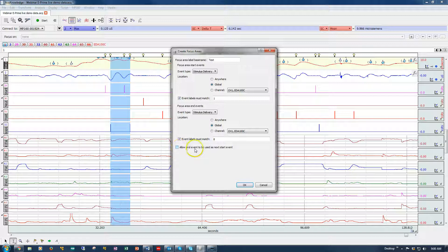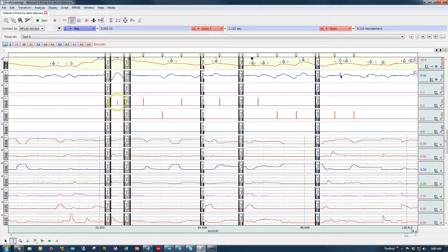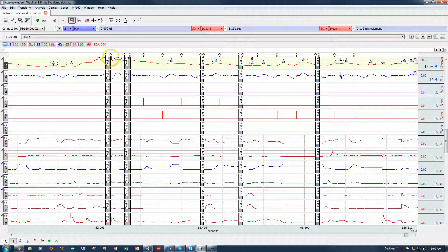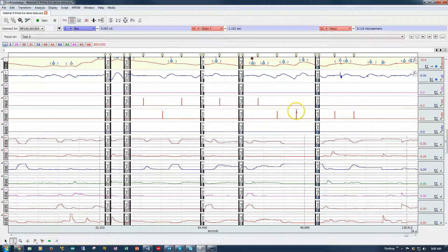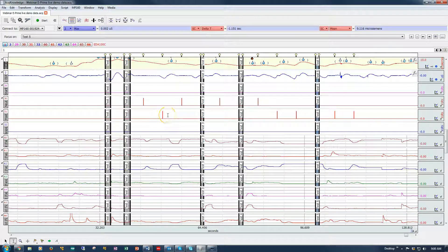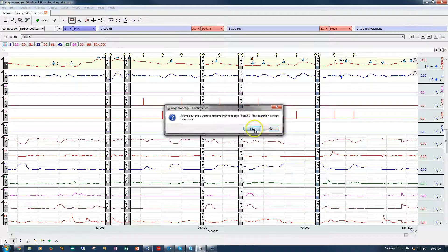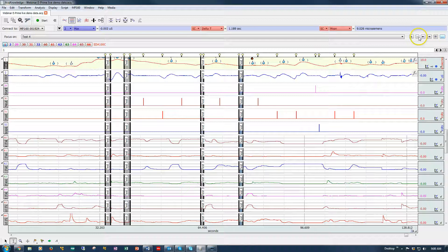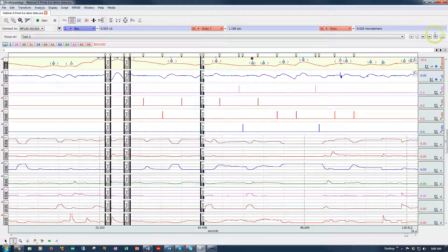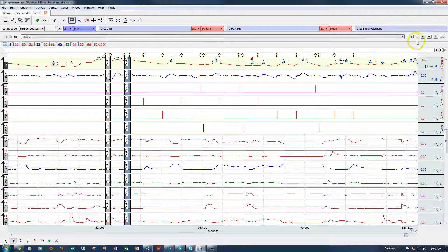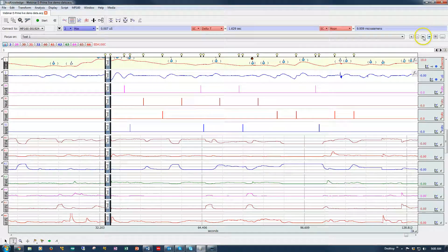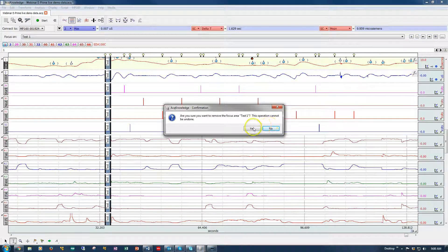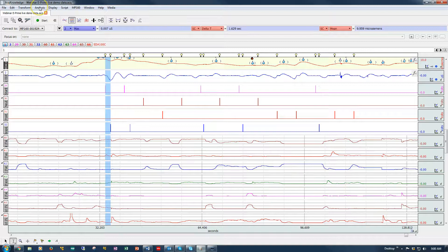I'm going to turn this off. So basically, we're going to select regions between marker type 1 and 8. So now we've got 1, 2, 3, 4, 5 different focus areas automatically created without having to go in and select regions or anything. I can delete these and we'll try something a little bit different this time.